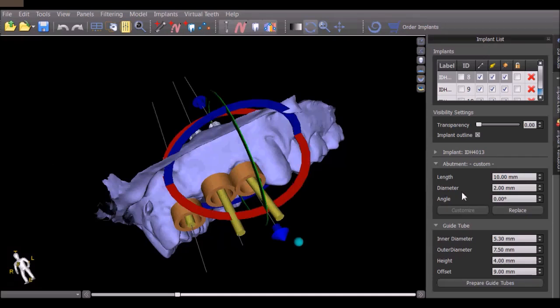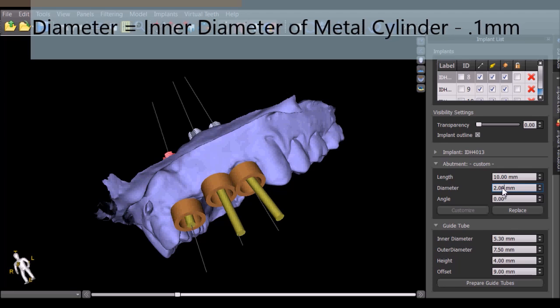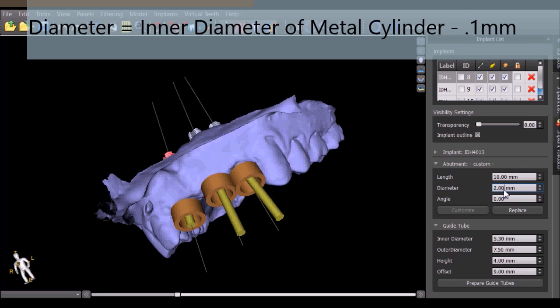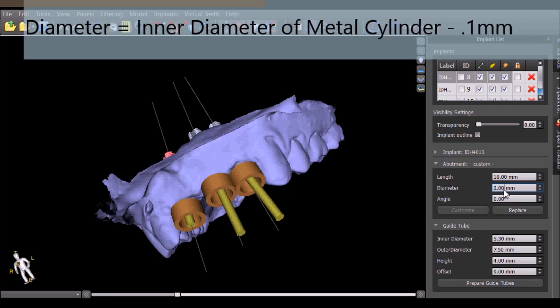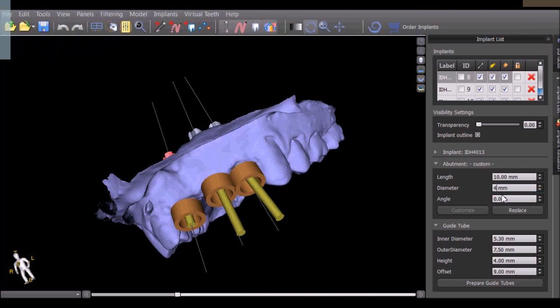The diameter of the abutment should be changed to be 1/10 of a millimeter less than the inner diameter of the metal cylinder. If we're going to be using a metal cylinder that has an inner diameter of 5.02 millimeters, then the diameter of the custom abutment should be set to 4.92 millimeters. The angle of the custom abutment should be set to 0.